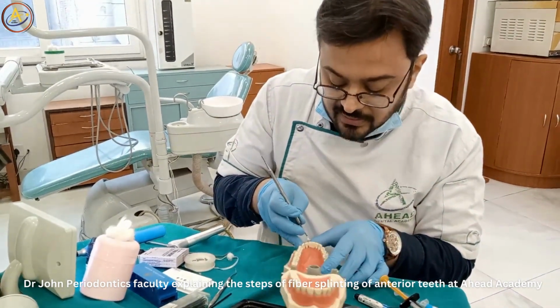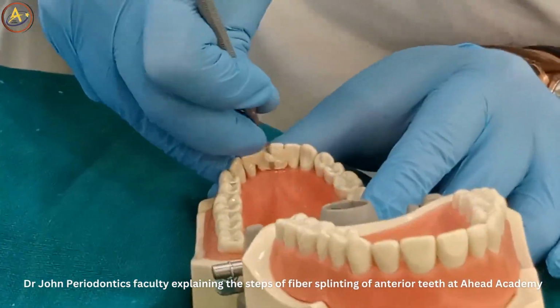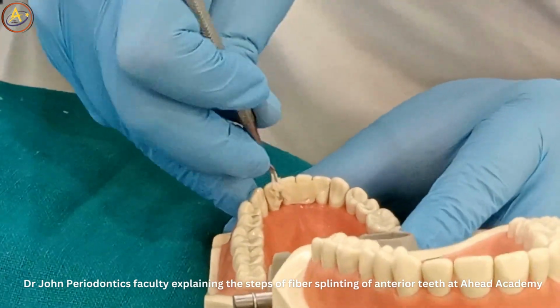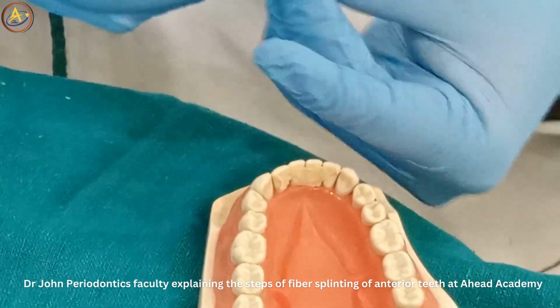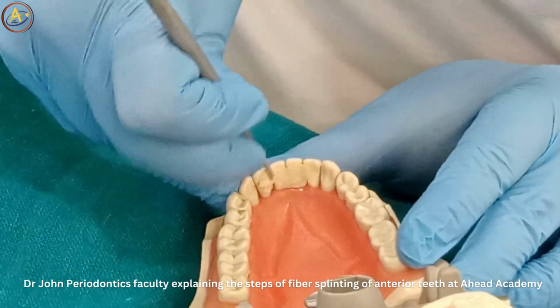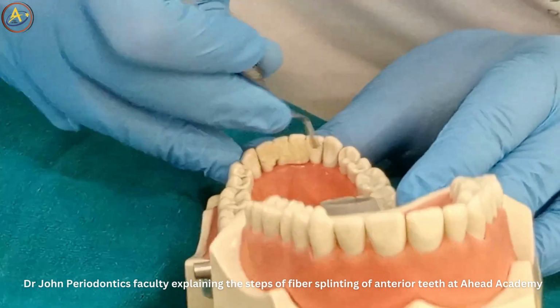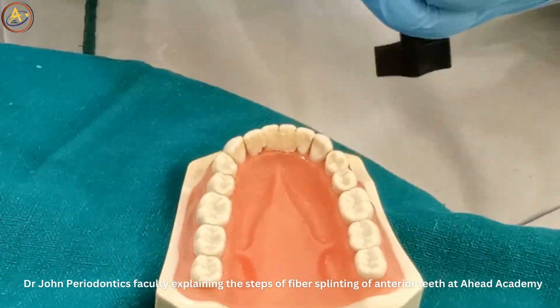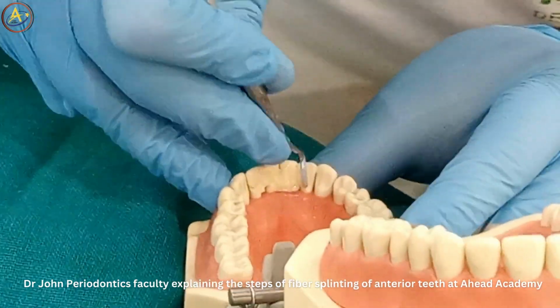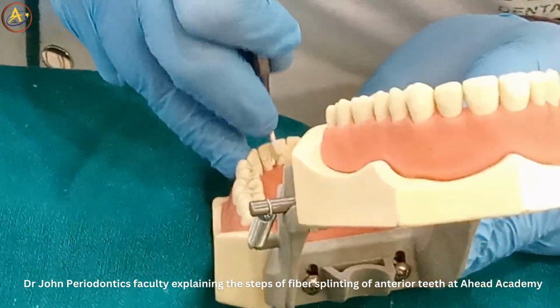Okay, I will request Idris to show the area of the composite which I am trimming, so that you all can see where we are applying and how we are applying it. Okay, it has to be very smooth and aesthetic also. Trim the composite, make it secure in such a way that from the front, it shouldn't look like something has been applied on the tooth. It should totally look like a tooth-shaped filling has been there, and the shade, color and aesthetics should be totally matched.